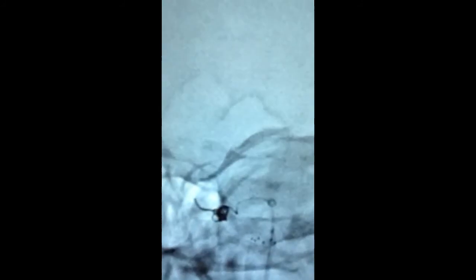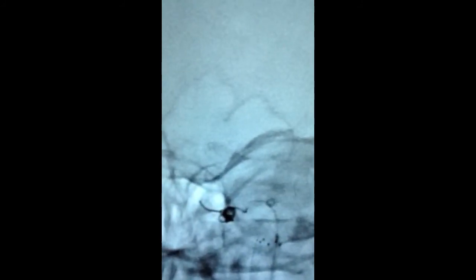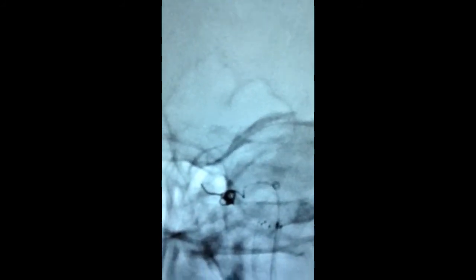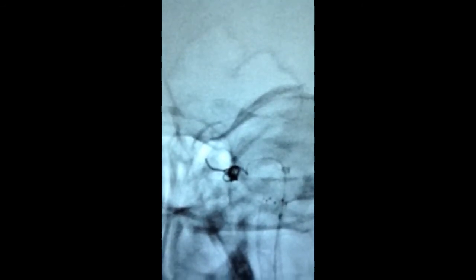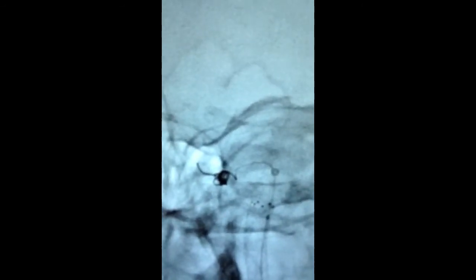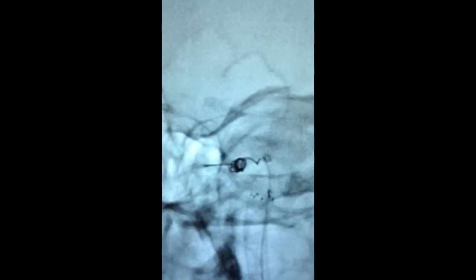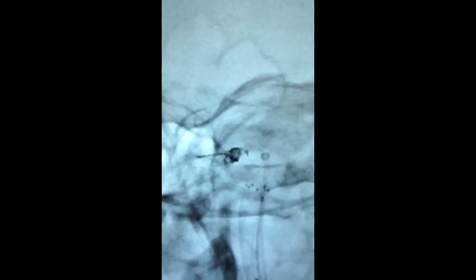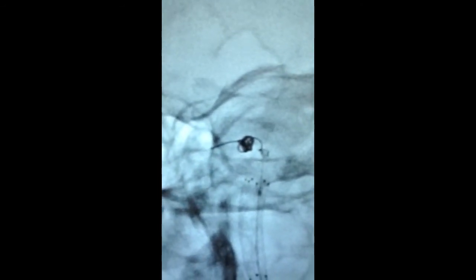This shows that the vessel is once again occluded despite the stent being in place. This is usually a sign that there is some clot more distally in the internal carotid artery. Now a MERCY device has been advanced, which is the coiled structure seen in the center of your screen. This will be advanced and then pulled backwards to try to remove any clot in the vessel that is keeping the vessel closed.